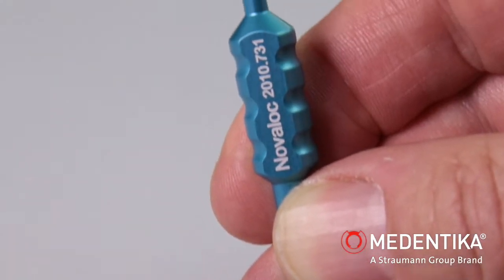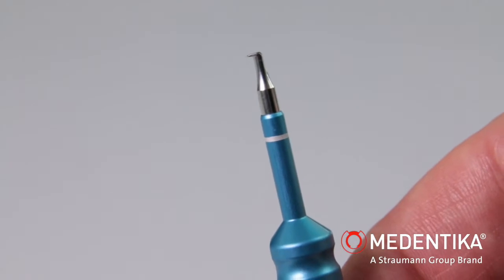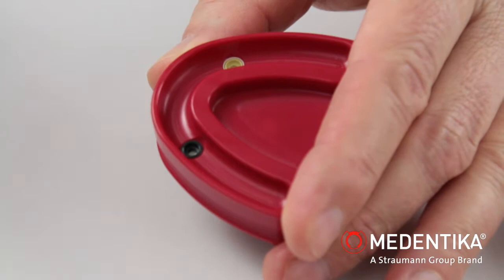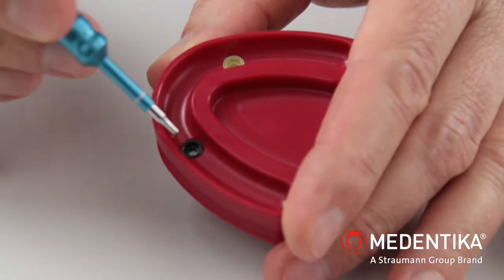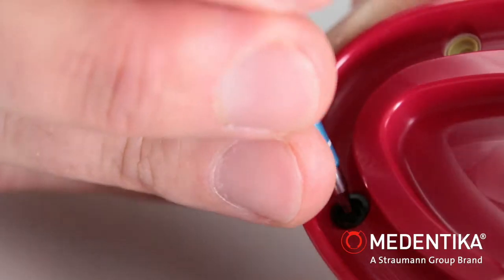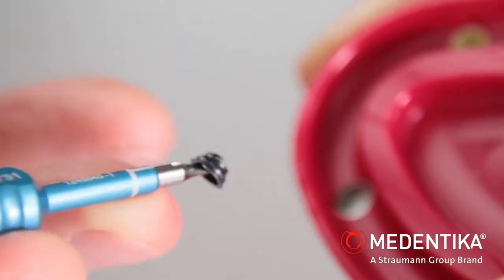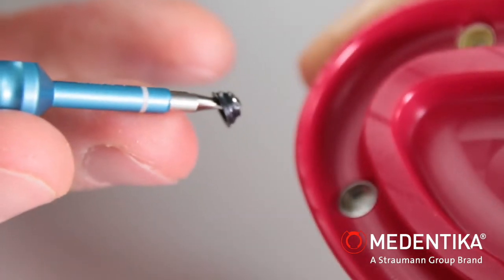Using the first function, the black assembly insert can be removed from the matrix housing with the aid of a small wedge on the tip of the instrument. The instrument must be inserted in the opening eye in the assembly insert. Once the instrument is in the final position, the insert can be extracted using a tipping motion.